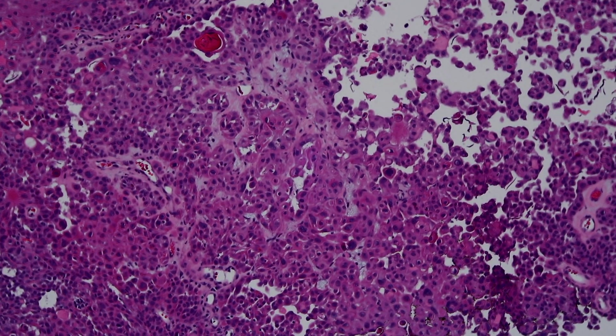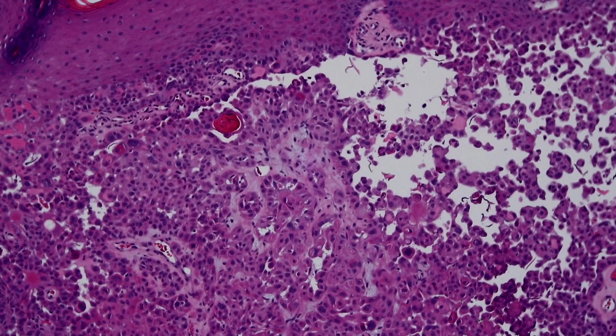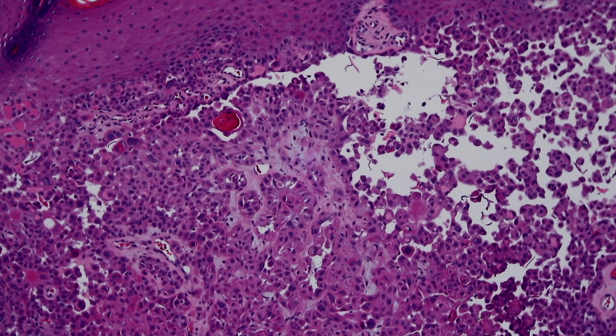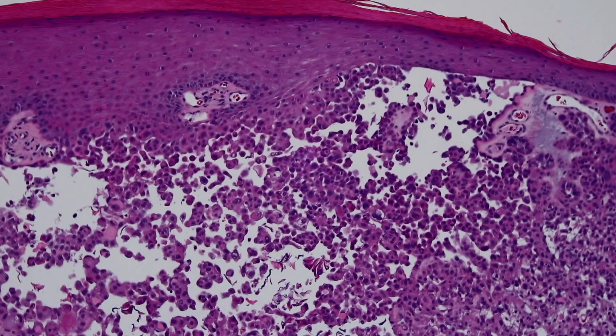In the past, people thought that these were more aggressive. Some recent studies, though, have not found that to be the case. But I think it's still important to recognize because this variant can be confusing if you don't recognize what it is. I've seen acantholytic squames that really looked like they had gland spaces or vascular spaces, so they could easily get confused with adenocarcinoma or even angiosarcoma if you weren't familiar with the pattern.